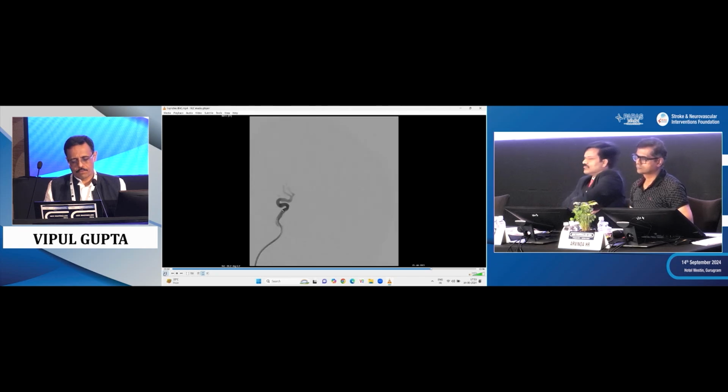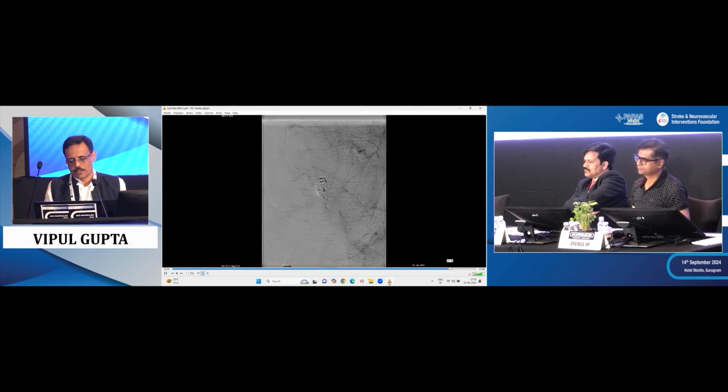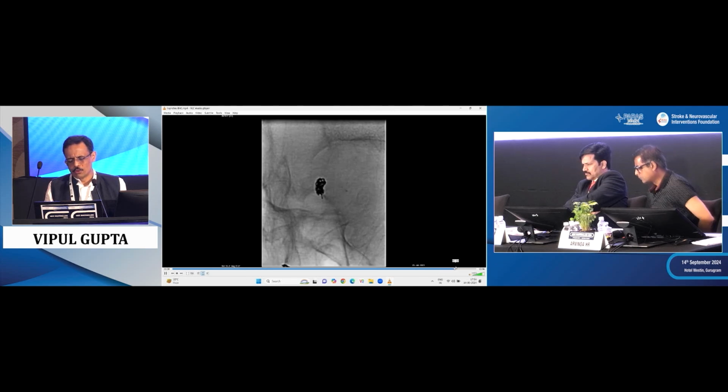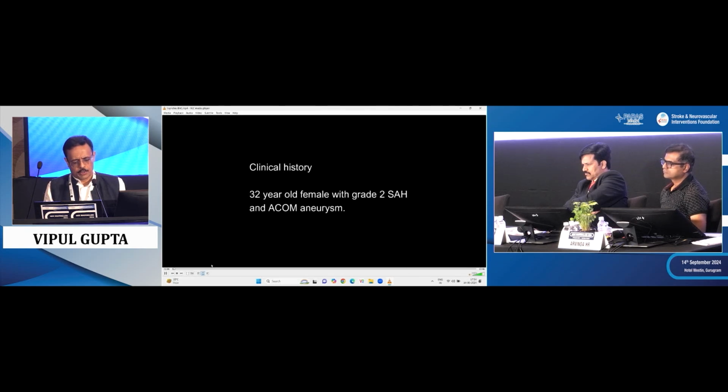So I don't think there is anything further. So when a tip like this is out, we watch it for a while. But small coil tips usually don't cause any thromboembolism. We just gave more heparin and aspirin, and the patient remained fine.